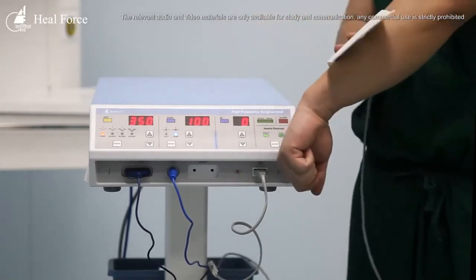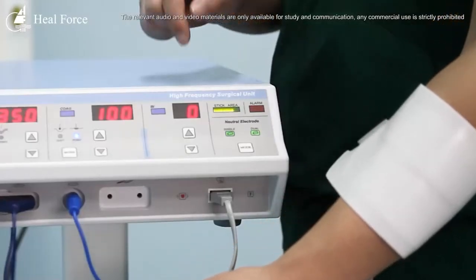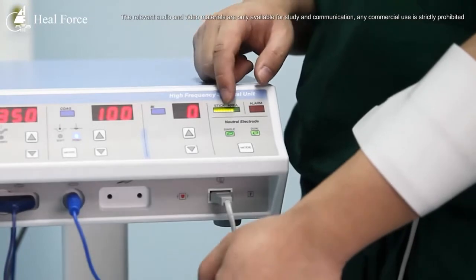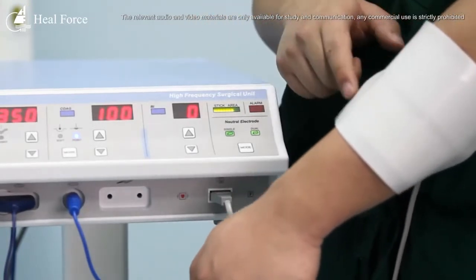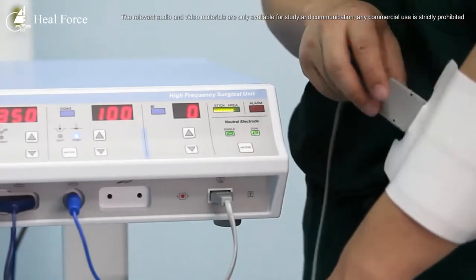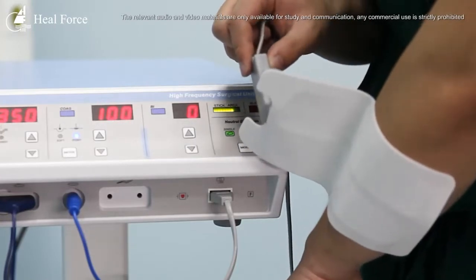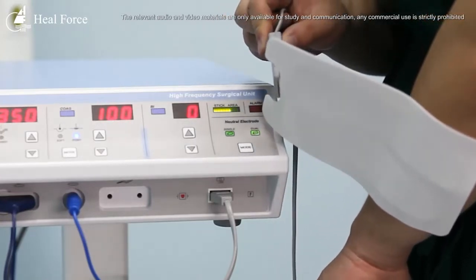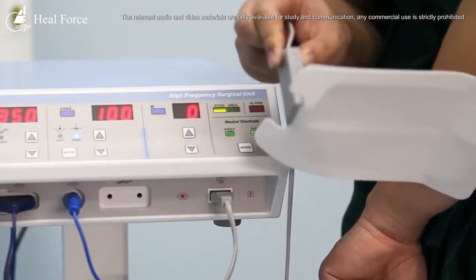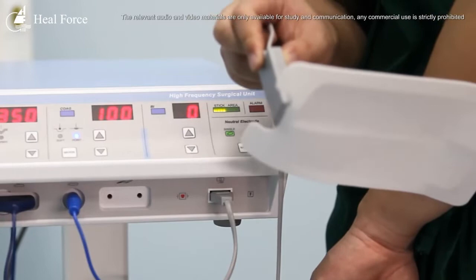Now I will attach the plate to the skin. We can see the stick area here, which indicates the percentage of the plate attached to the patient's body. When this plate goes off the patient, the stick area reading will decrease, and when the entire plate has fallen off, the alarm will come back on.